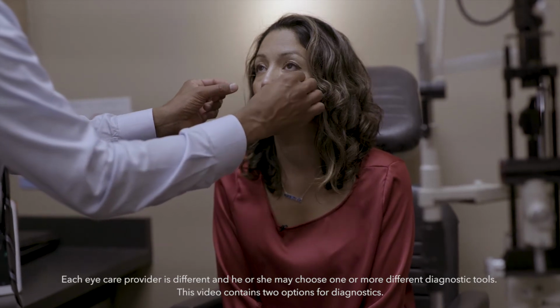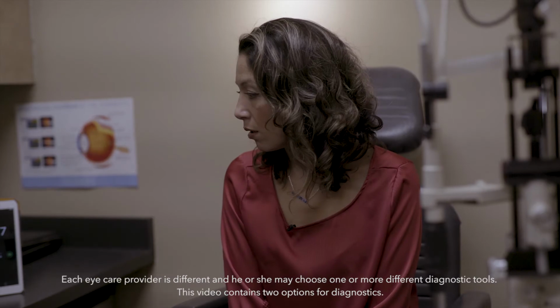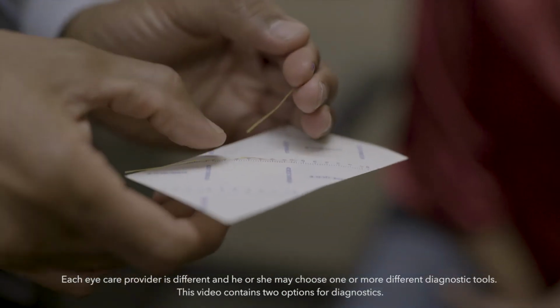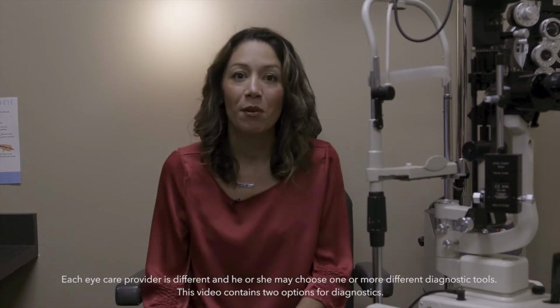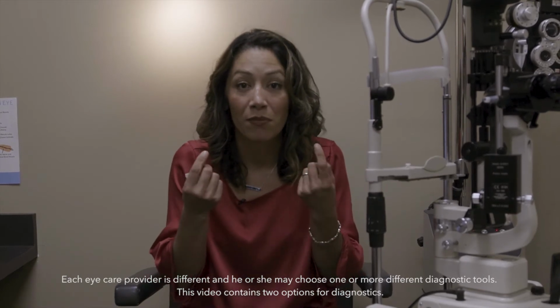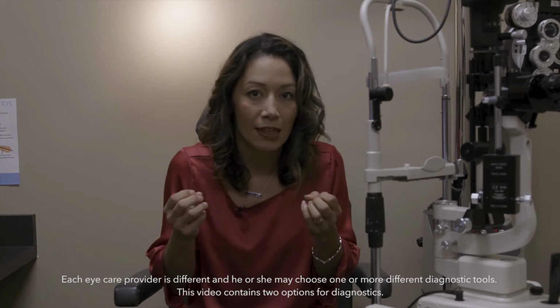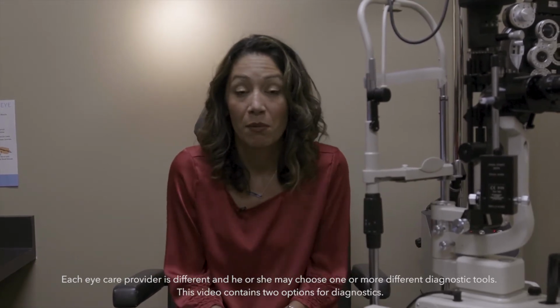Doesn't it cause reflex tearing though? No, not really. It's not supposed to. And even if it does, it's okay. So we measure how much dryness you have. You just put this on 0. The ruler's on the back of the sheet. So that was really strange. I just had these little threads hanging from the edges of my eyes, and I didn't feel anything other than a little bit of a tickle, and outside of that, that was it.